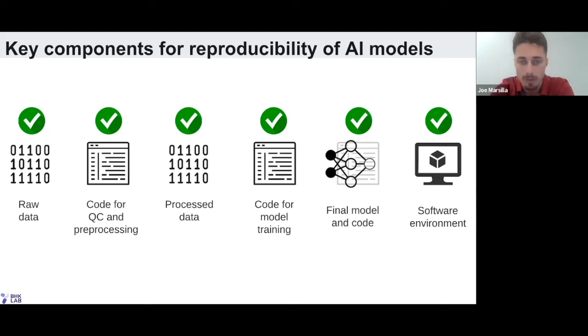And so the data that you see in the RADCURE vector folder, if you have access to the H4H on vector, you'll be able to see that the imaging data is given to you in terms of a CT image, and there's a folder with all the structures. One thing I would like to note: the current way that it was extracted conserves the spatial settings of the original patient. So if you want to standardize the spacing, you'll have to do that separately in your scripts.